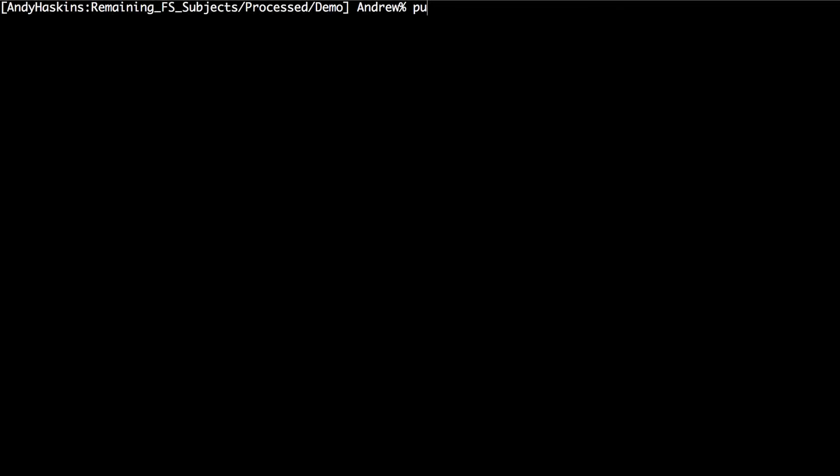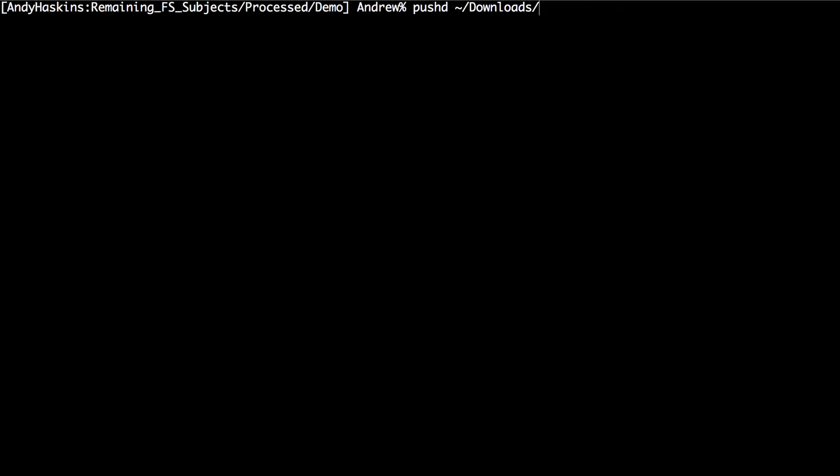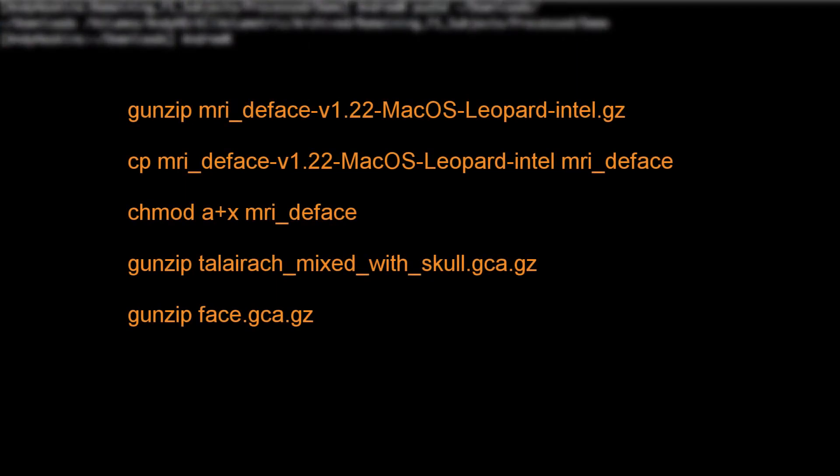Then, go to your downloads directory and run the following commands to unpack the files and to make them executable.